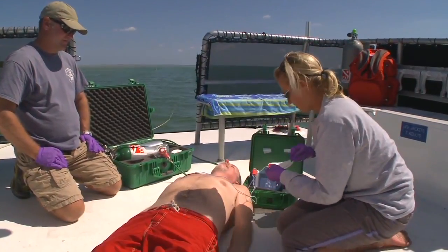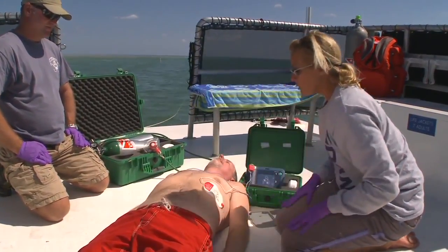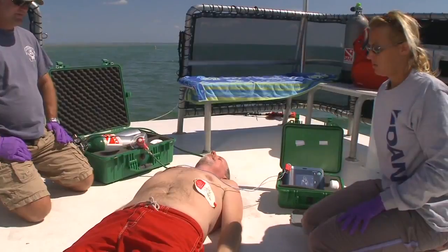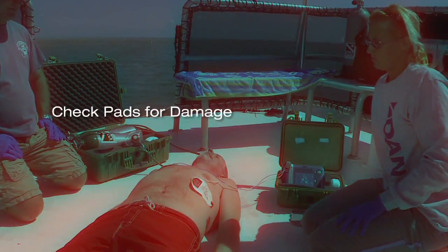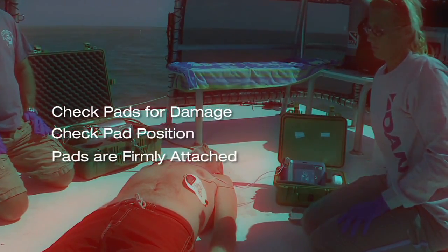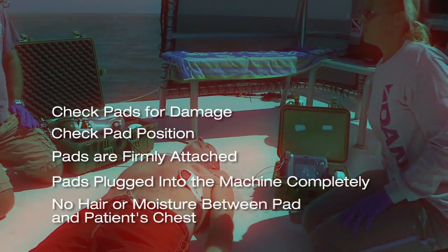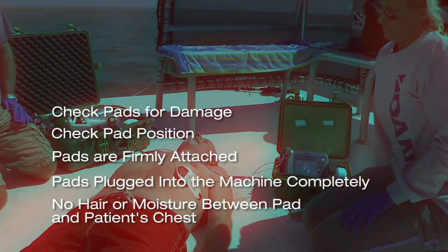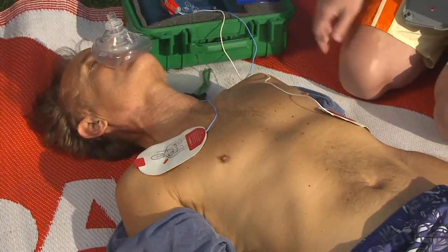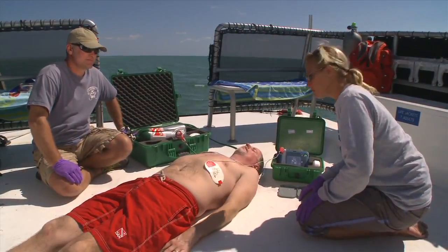There are several things to check if the AED can't analyze the heart rhythm. Pad problems are the most likely reason. The unit itself will offer suggestions such as: check pads for damage, check pad position, make sure pads are firmly attached, make sure pads are plugged into the machine completely, and make sure there is no hair or moisture between the pad and the patient's chest. If the unit still has trouble analyzing, stop all movement and do not touch the patient. If you're on a boat, minimize vibration by stopping the engines.